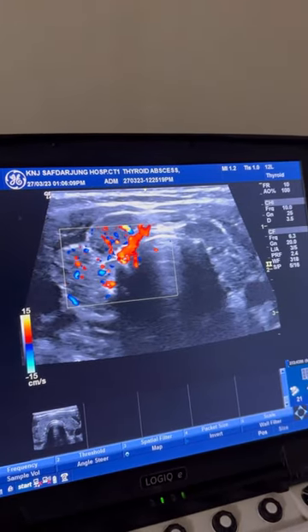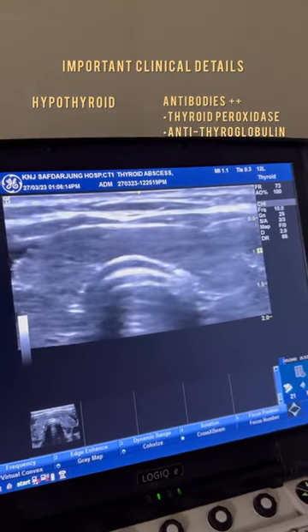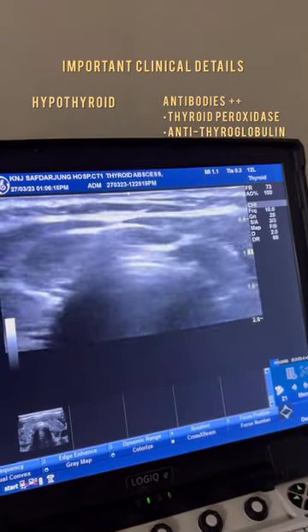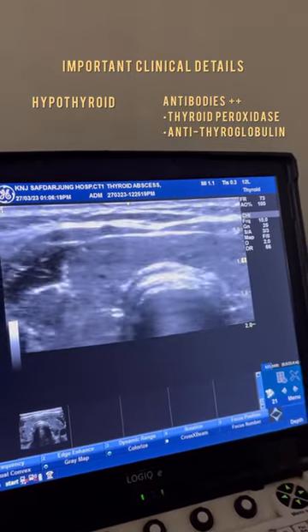Increased vascularity may happen in 5% of cases of Hashimoto thyroiditis. So because of the hypothyroidism and presence of these antibodies, this is a case of Hashimoto thyroiditis.